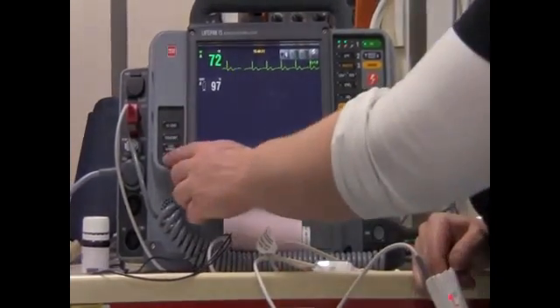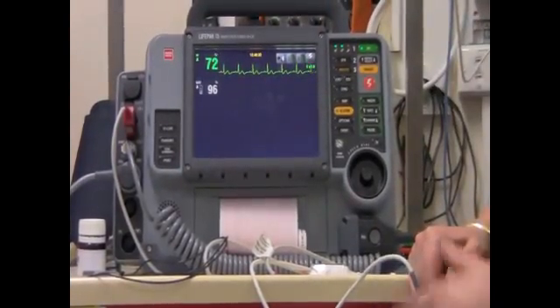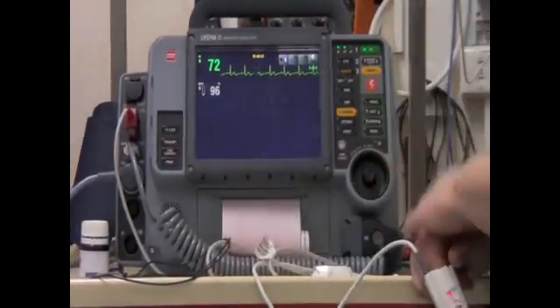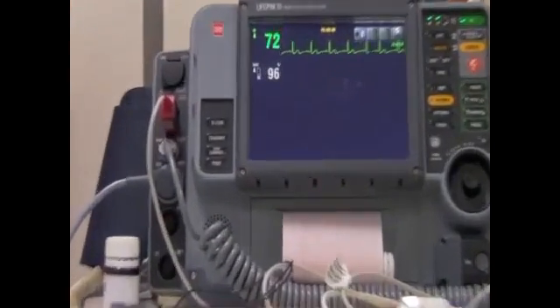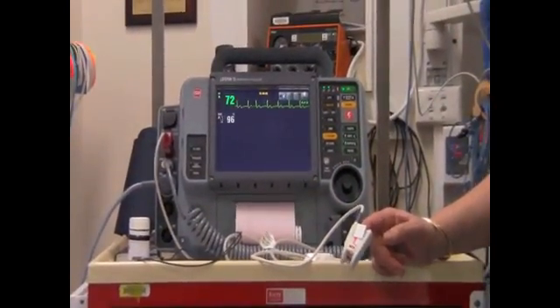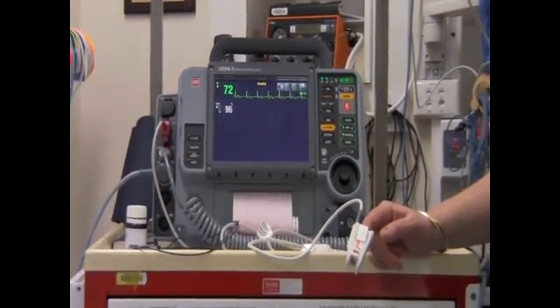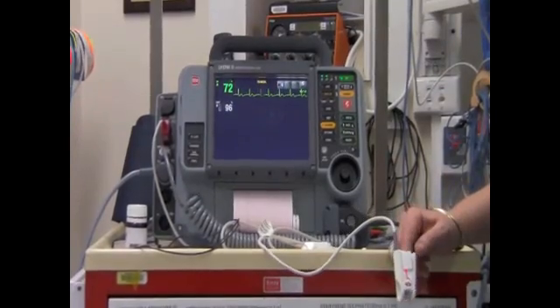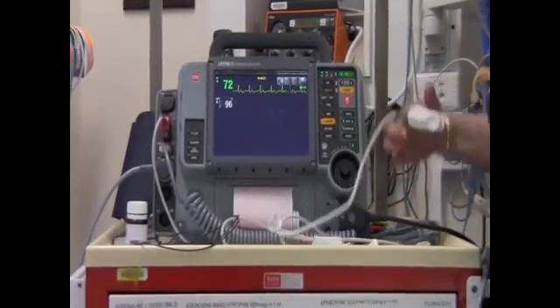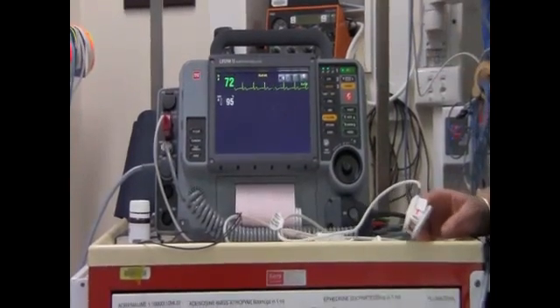And a print is if you just want to print. If you notice there was something abnormal on the cardiac monitor, you could just hit print quickly, and that would show you some of the waveform from there, the ECG tracing. These are the new machines that the retrieval services and the ambulance are going to use for transport. So it's designed to be pretty tough and hardy, and it's also got good battery capacity, and it's pretty self-contained with everything in it.